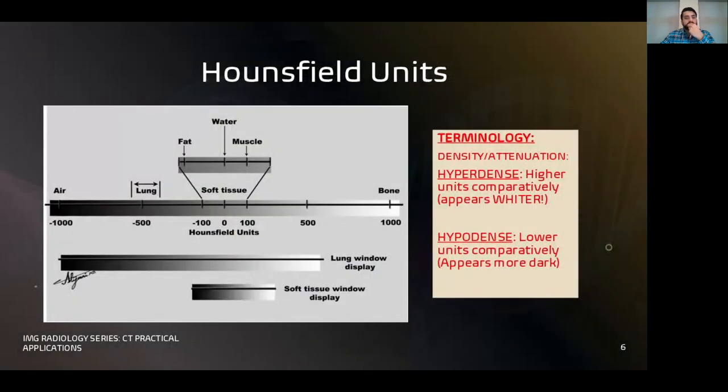Okay. So we can move on to the next bit where we talk about the Hounsfield units. Essentially, when a person goes through a CT scan, the CT scanner directs a number of x-rays to the patient, and it happens in a 360 degree motion. When the patient is exposed to those x-rays, they calculate what the patient would look like using something called voxels. Now, a voxel is basically a small unit, and they're a bit like pixels. So if you put those pixels together, you then form the whole image.